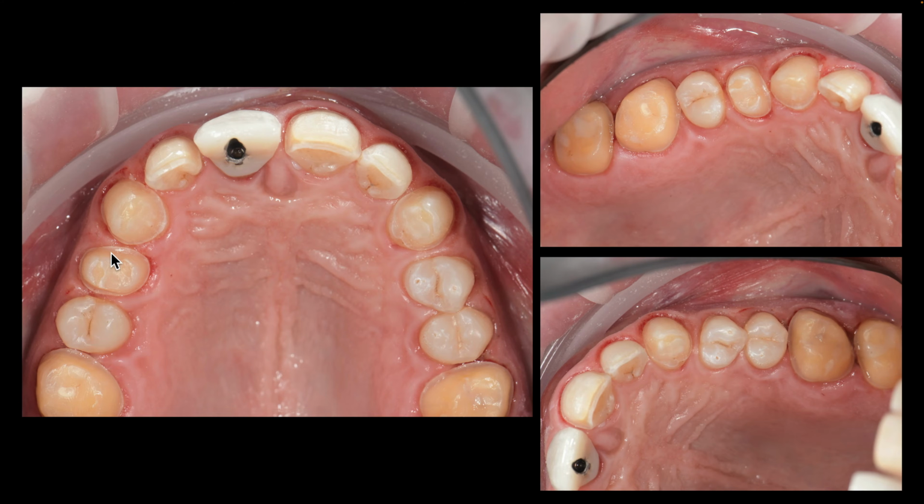Even this crown here, this was a tooth with a craze line or crack line from mesial to distal, but it was determined it didn't need endodontic treatment, so we did kind of this 360 veneer type crown. It's a light chamfer most of the way around because I wanted to keep it conservative. And then this is a light veneer that's going to overlap the occlusal. So we just rounded this whole intersection between the veneer and the occlusal. And Harold's going to just build this as an occlusal veneer, an onlay veneer. Same with this side, both of these bicuspids. I didn't feel the need to prep them full coverage like this one because there was no cracking.